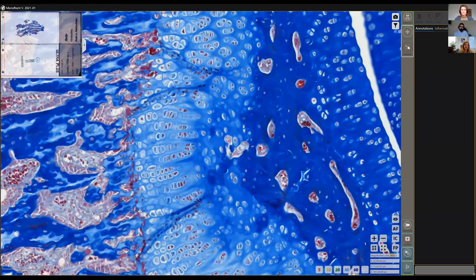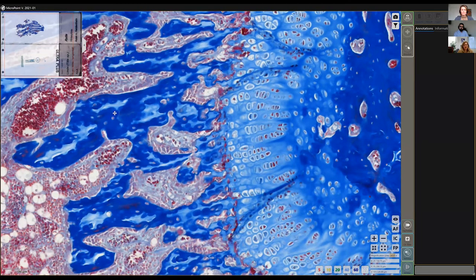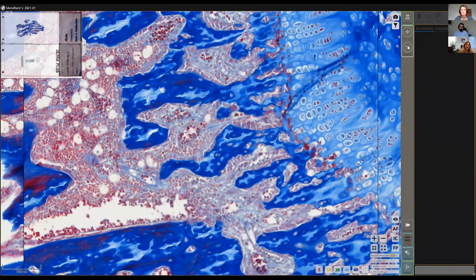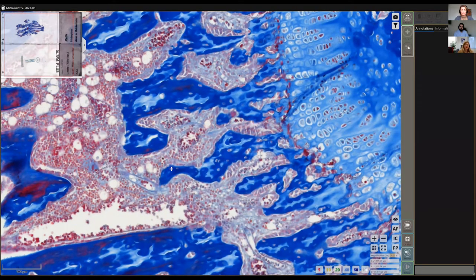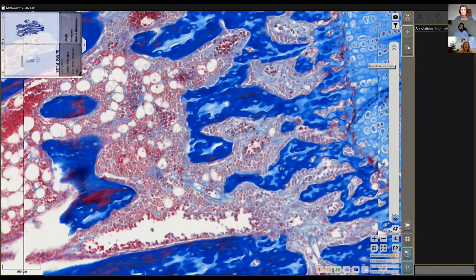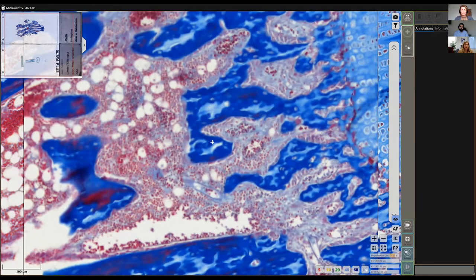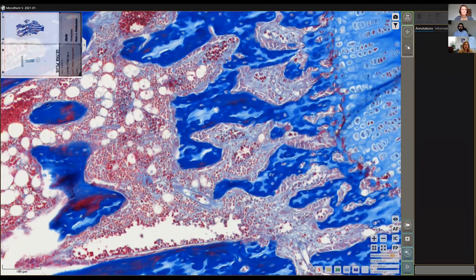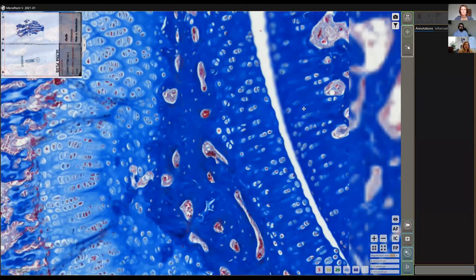You can hear the device working in the background. In this mode, you can refocus — many samples are not flat but have topography like Switzerland, so you can press autofocus to refocus. If that doesn't work, you can go into manual mode, using the fine drive you know from an analog microscope, to get the right level of focus. Then click back and it takes that plane into focus.